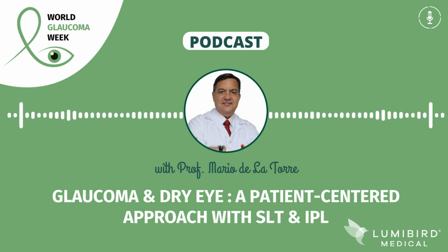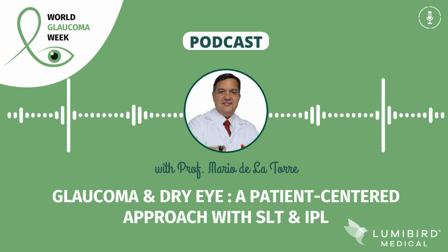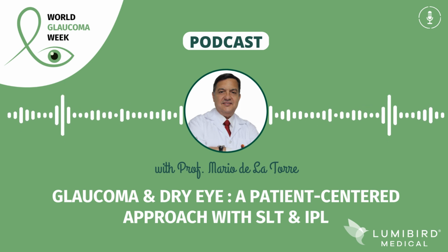Great. So, were there additional glaucoma assessments done for this patient? Yes, we did the routine examination. That means gonioscopy, visual field, examination of the optic nerve, measurement of the ganglion cells, the fibers around the optic nerve, and so on. But very important, when we performed gonioscopy, it showed an open angle, but in 2 quadrants, a suspicion of plateau iris.